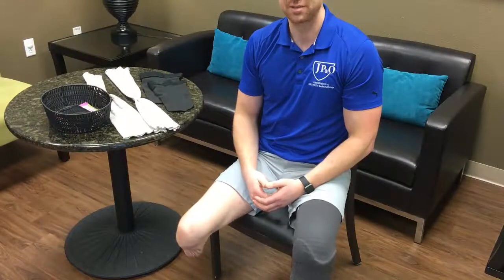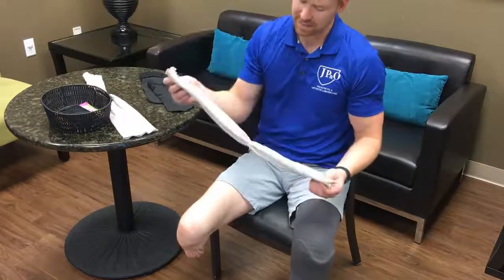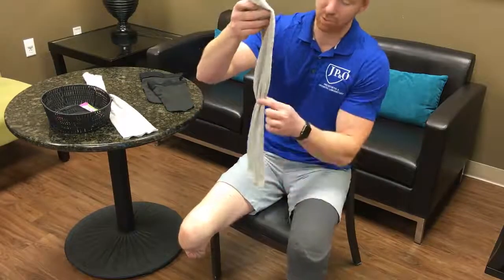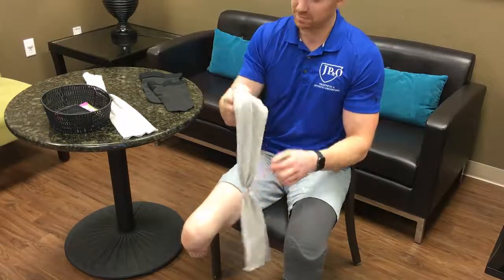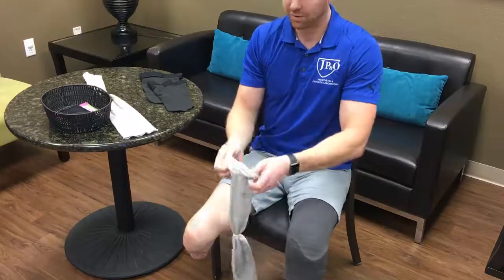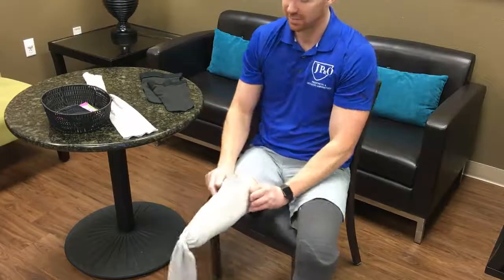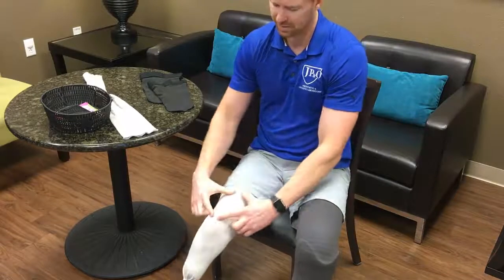The second shrinker sock that we're going to talk about is the tube-shaped one. And as you can tell, this one is slightly different than the other one, where it has a ring in the middle of it. I want to show you how to put this on. What we're going to do first is slide the shrinker sock up roughly 3 to 4 inches above our kneecap, right there.